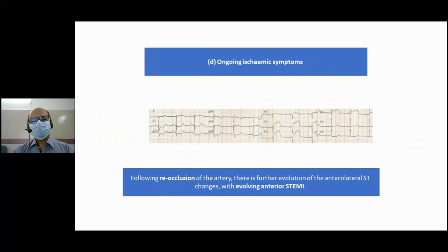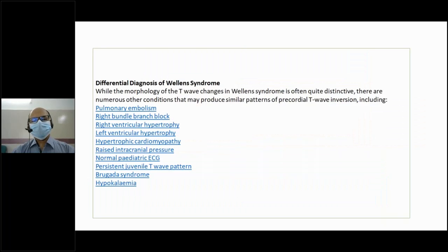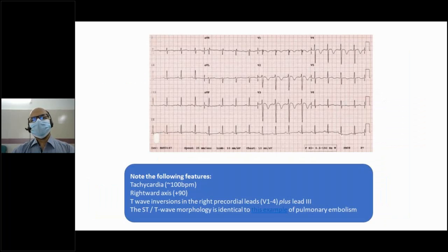This is important. This is another ECG, myocardial ischemia. So we will observe carefully. This is myocardial ischemia.